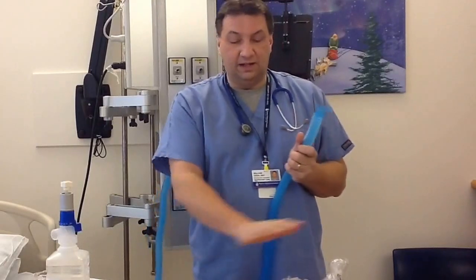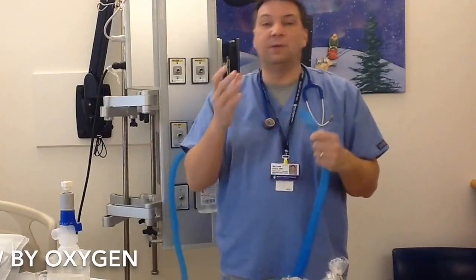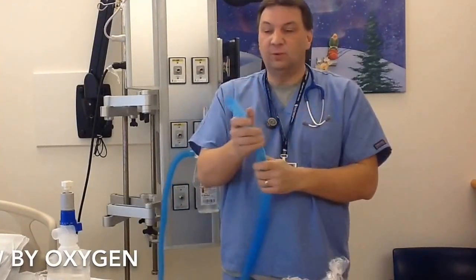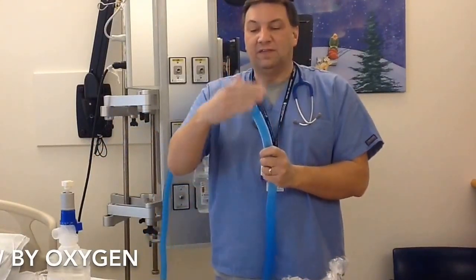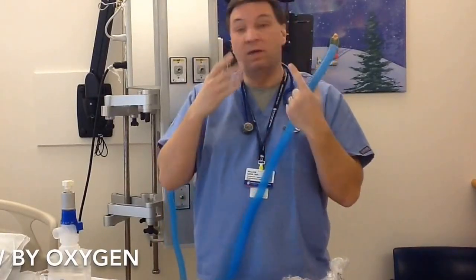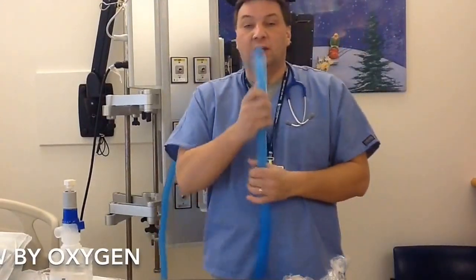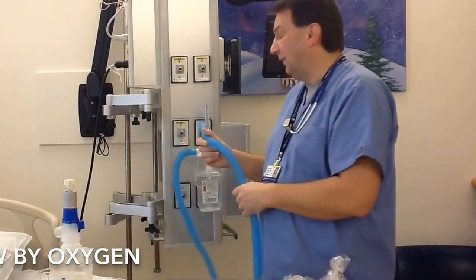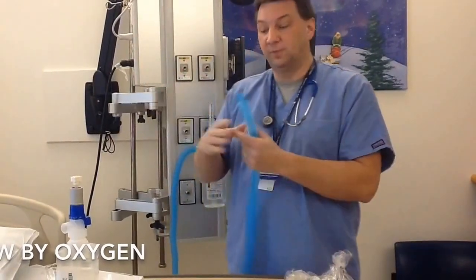Right now, if we don't connect anything else to it, this is called blow-by oxygen. So if your patient is requiring a little bit of oxygen, they may be fussing around a little bit and you can't get the mask on the patient, you could just provide a little blow-by oxygen, and this mist goes into the nose, mouth, whatever the patient might be breathing, if they're a nose breather or a mouth breather, and we're providing a cool mist along with oxygen. The only negative thing about this is we can't guarantee how much oxygen is being delivered. Even though we're set at 40, obviously we're entraining a lot of room air and diluting it further, so this is not good if you need to really increase oxygen saturations from the pulse oximeter.